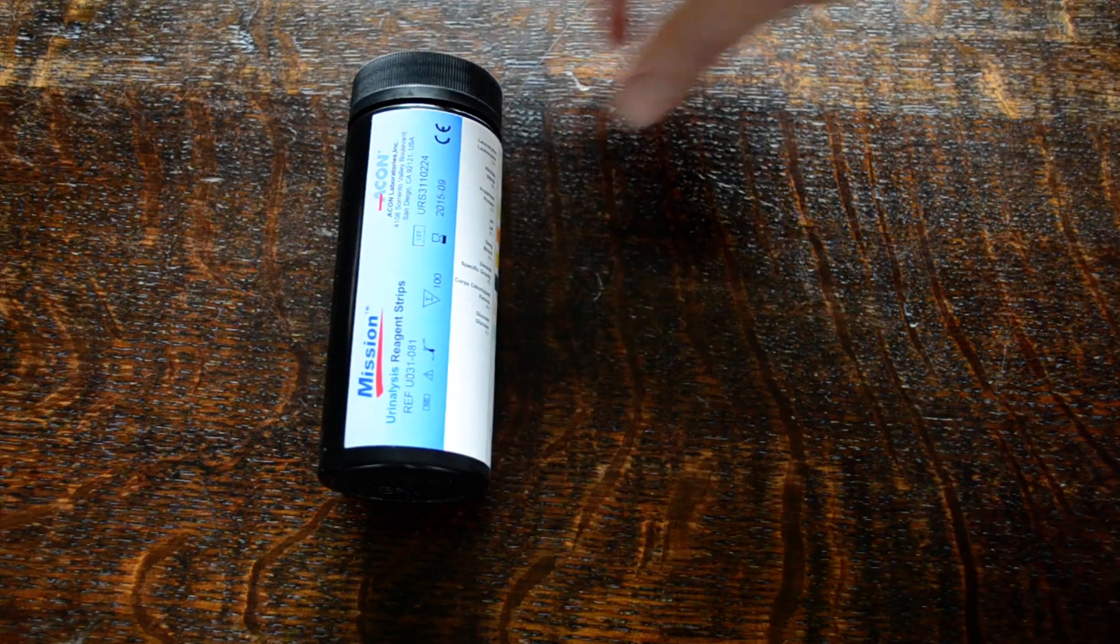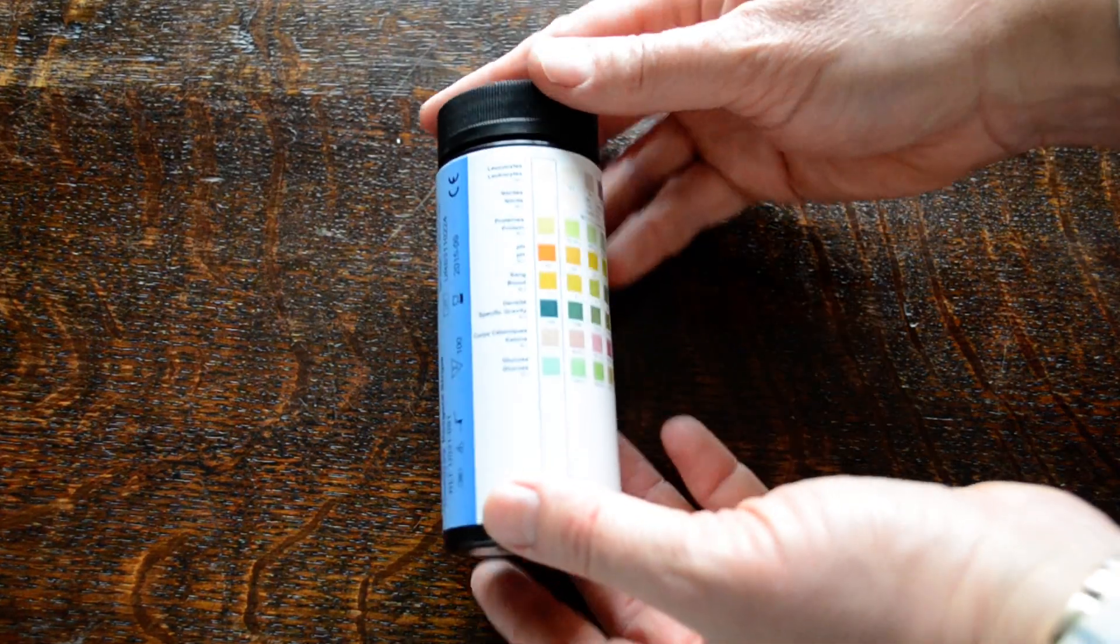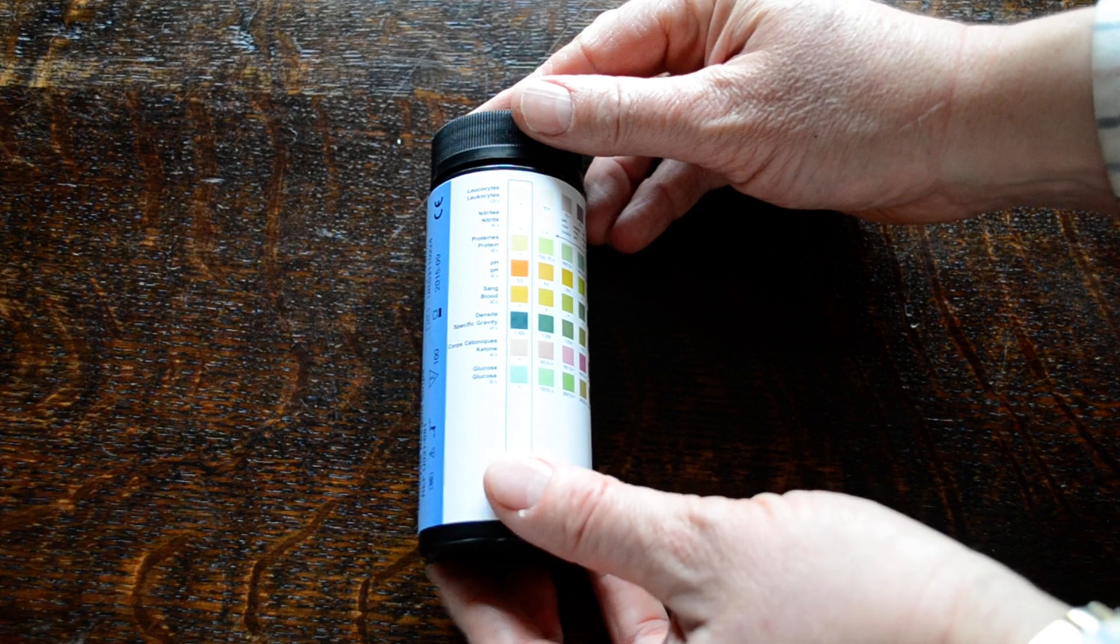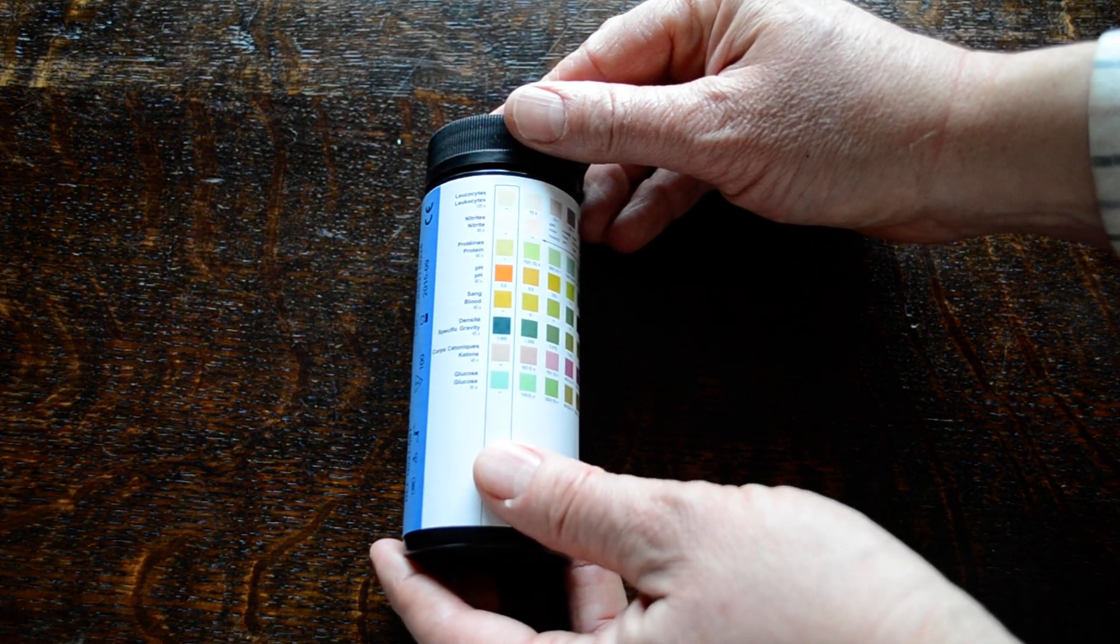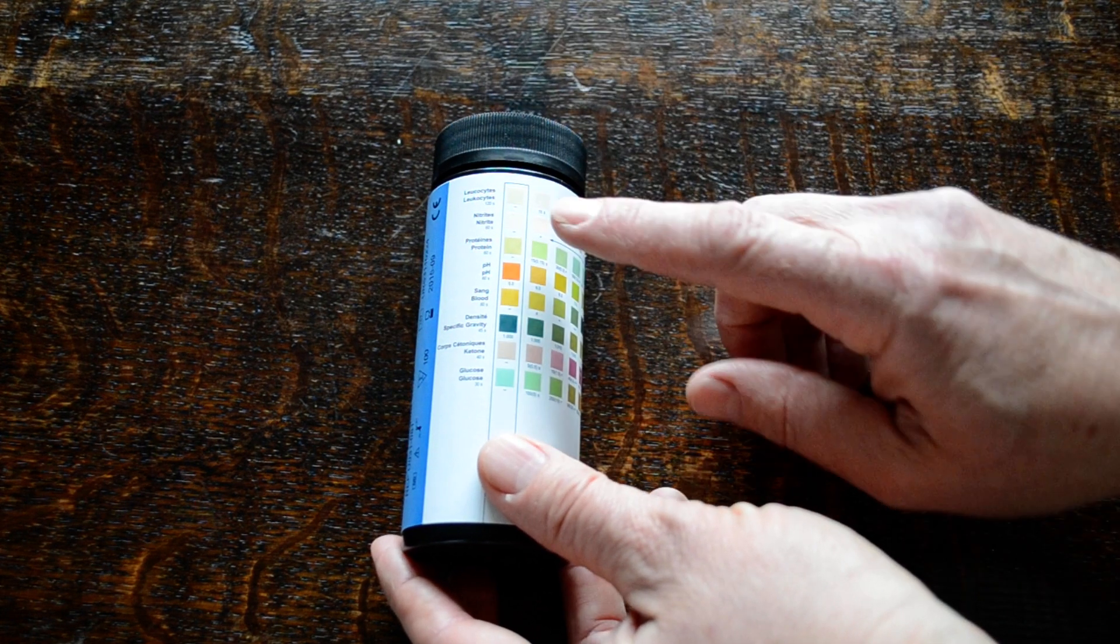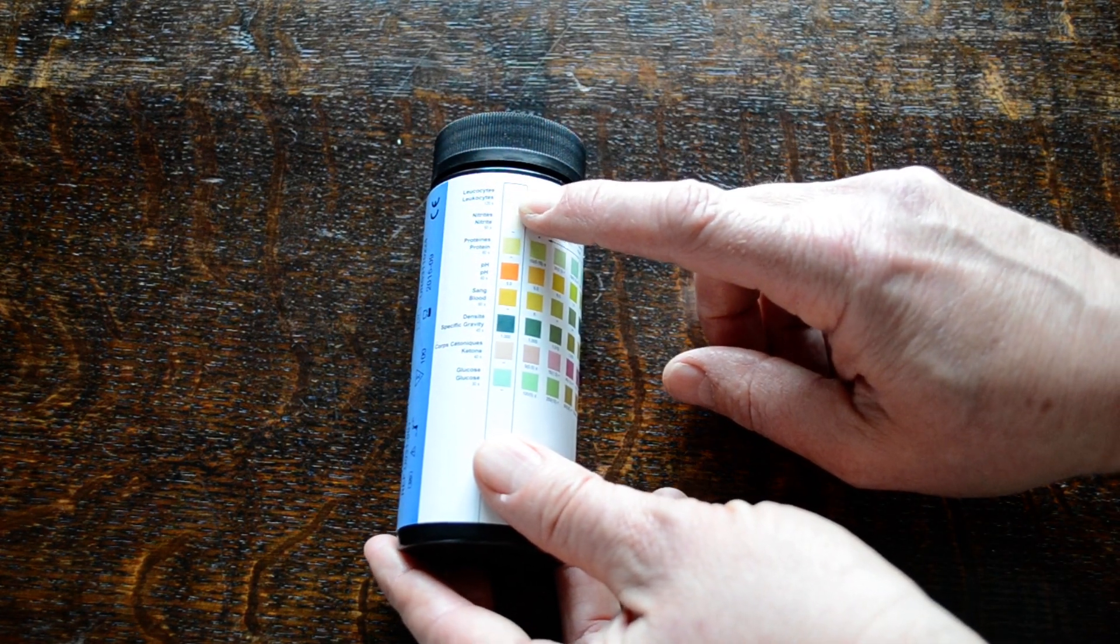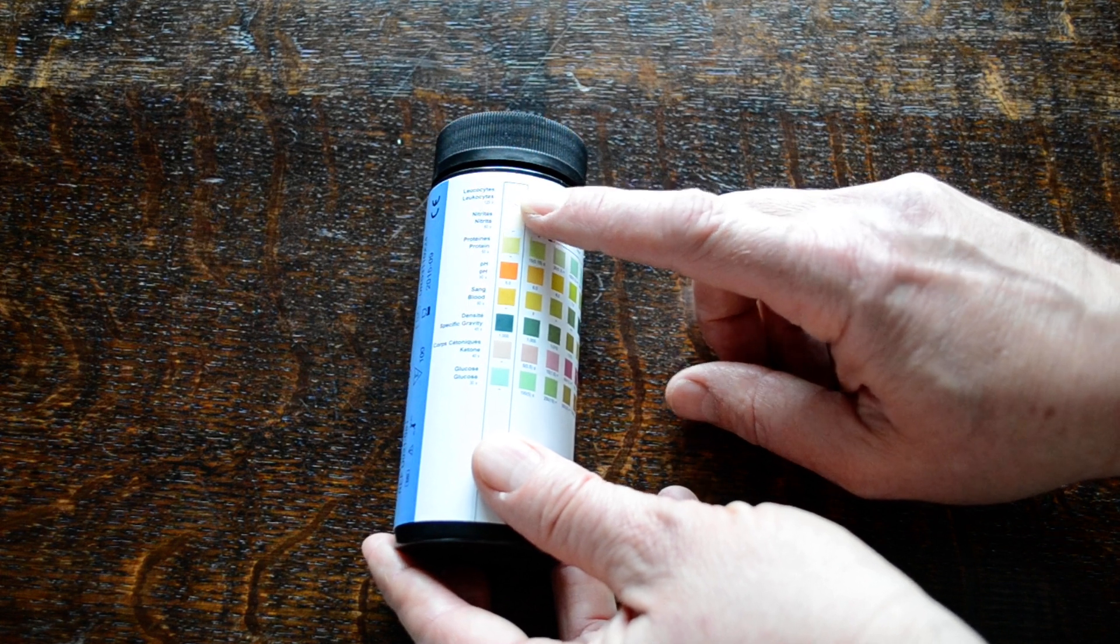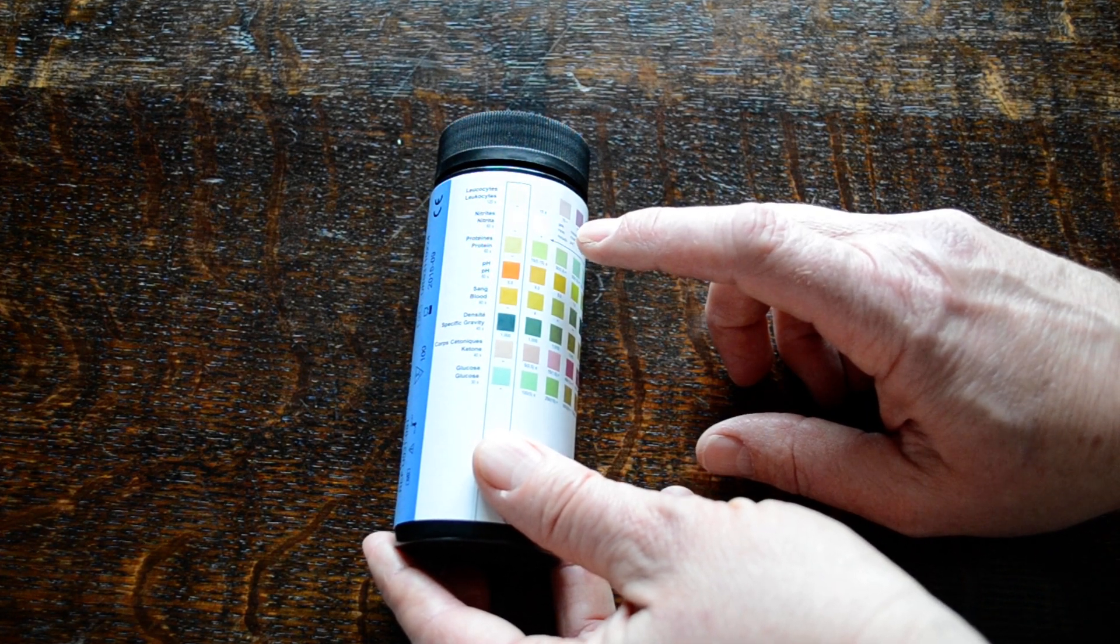We're going to concentrate on a couple of the parameters on this eight-pad test strip. The particular ones of note when we're screening for renal tract infections, cystitis, or bladder infections are leukocytes, which are white blood cells which wouldn't normally be present in urine but are commonly there if there's a good going infection.